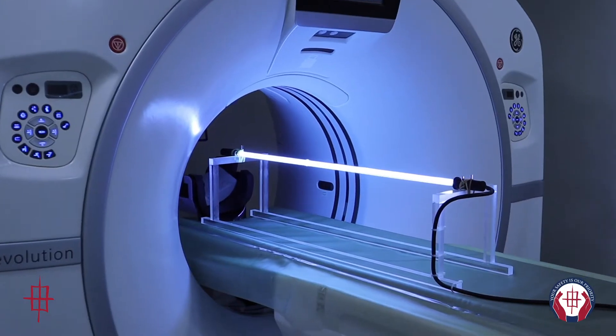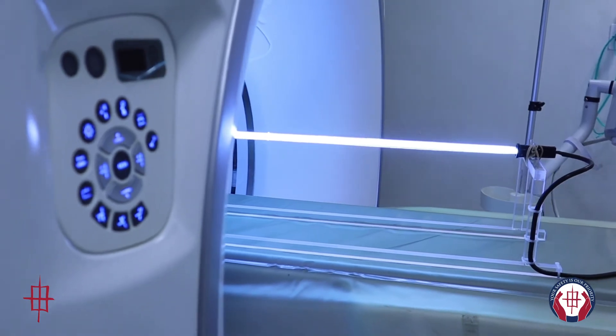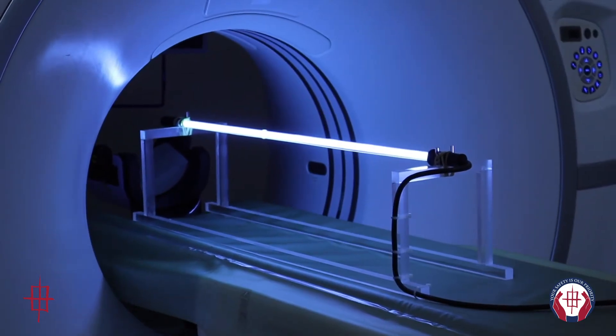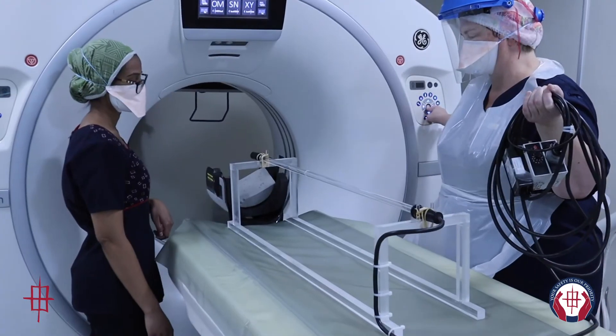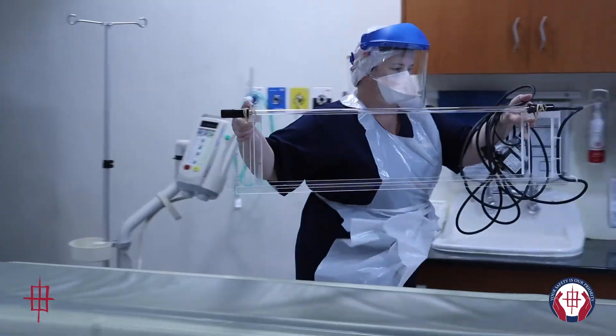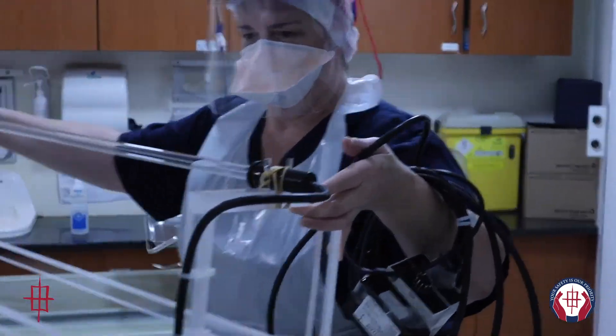The rooms are briefly closed during UVC sterilization. This process takes less than 10 minutes to complete and absolute sterility is ensured. UVC sterilization is much quicker than the conventional four-stage wiping process, thus reducing patient waiting times to the minimal possible without compromising safety.